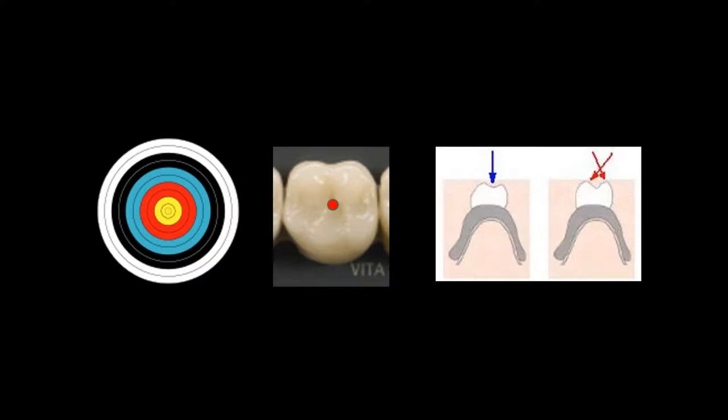The hit and slide is what rocks the denture base. The hit and slide causes the problem. It causes that minute deflection, which causes the denture to rock.